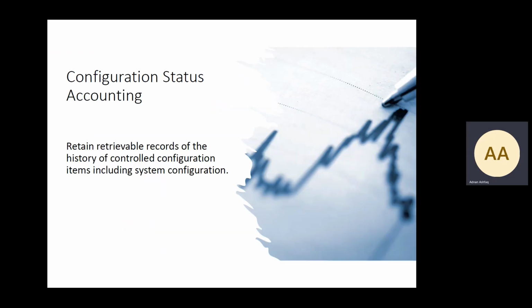Configuration status accounting: retain retrievable records of history of controlled configuration items, including system configuration.